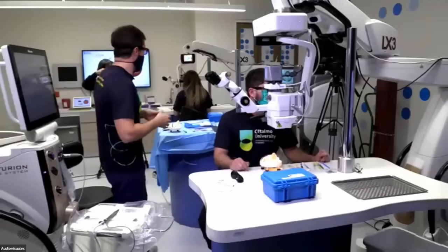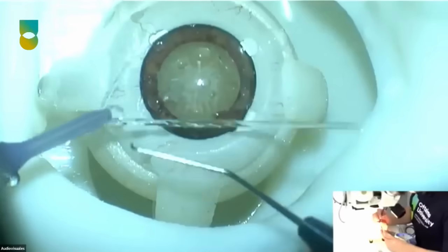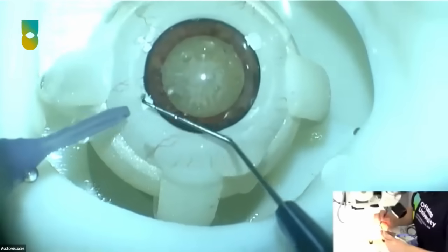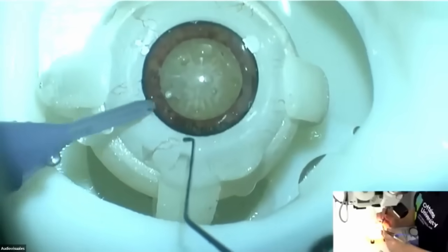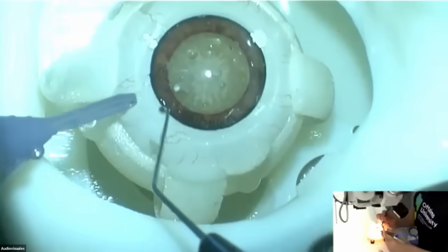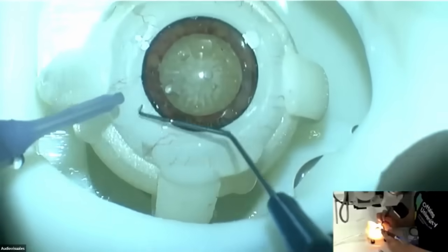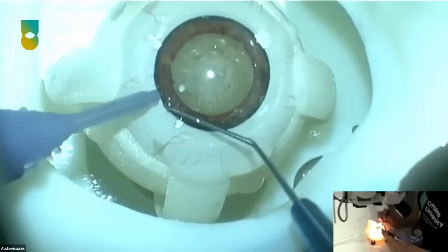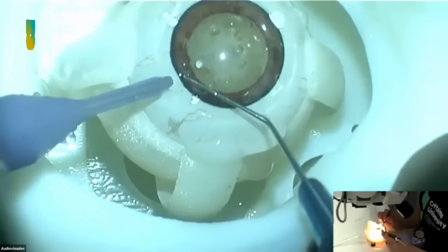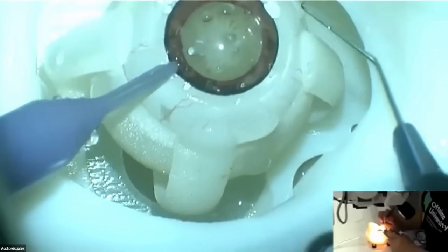There are theories about how we learn, and when you can mix what you're seeing with what you're hearing, with how the anterior chamber is behaving, it is very good for learning. In these models, this lens behaves very similar to the human eye, and this is very important for learning. Okay, so yes, the eye is moving a lot.